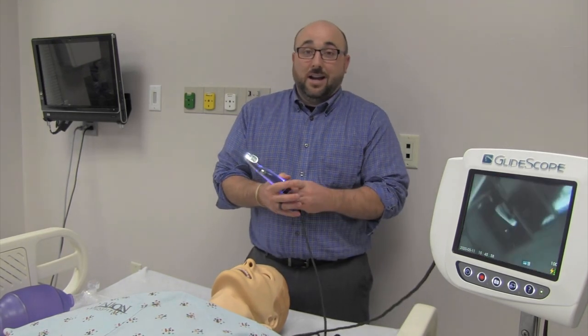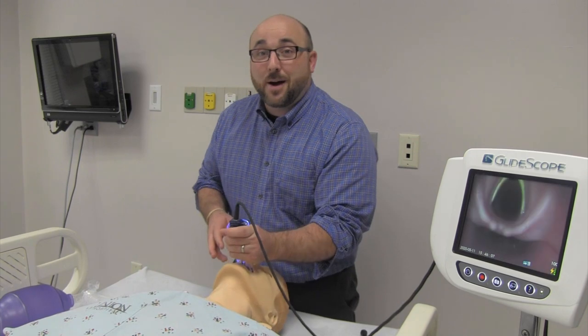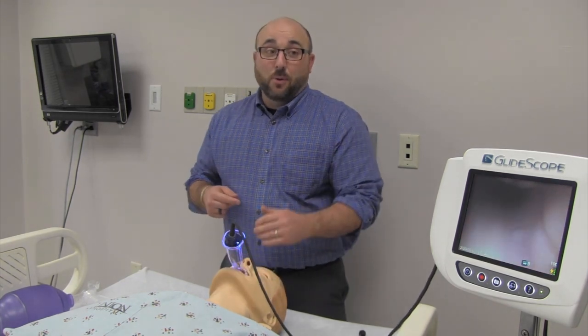One of the best things about video laryngoscopy is that when I intubate and find the right spot, everybody in the room can see the tube going through the cords. That is the number one way we confirm the endotracheal tube is in — watching it go through the cords. Other confirmation methods include waveform capnography, chest x-ray, breath sounds, and bilateral chest rise, but watching it go through the cords and having everybody view it is really important.